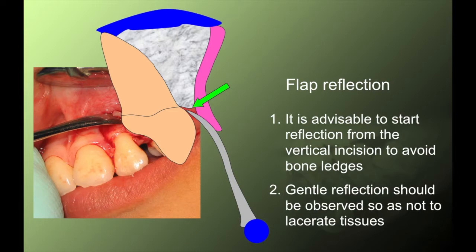When we reflect tissue along the marginal rim incision, remember the bony ledge on the crest. It is best recommended to start off with the prying motion of your mucoperiosteal elevator, navigating the ledge before you actually start to shift to a push or even a pull motion of your MPEs.